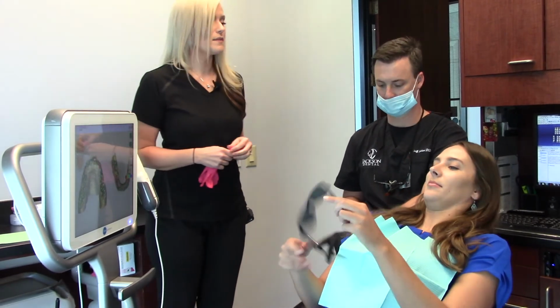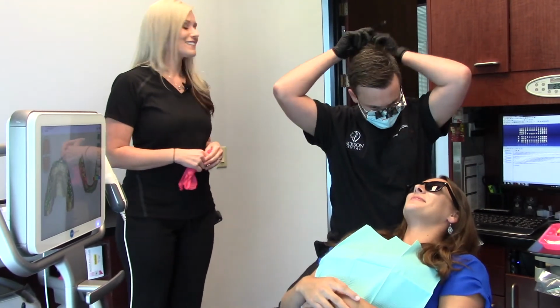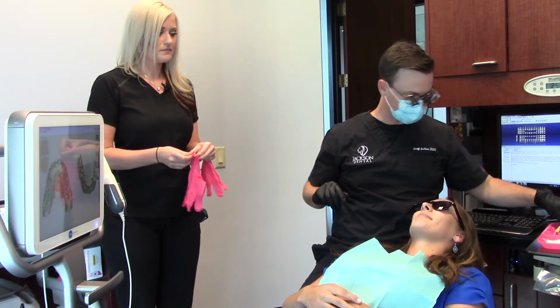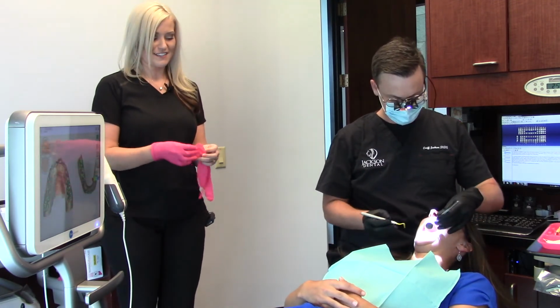Ms. Morgan, you can go ahead and put those sunglasses on. That way he's not going to have a bright light in your eyes. Excellent. Here we go. How did Anna treat you? Really good. Squeaky clean. No complaints. All right. Exactly. Good. She's a wonderful patient. Good.